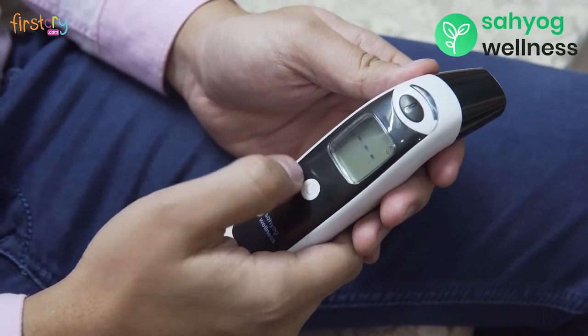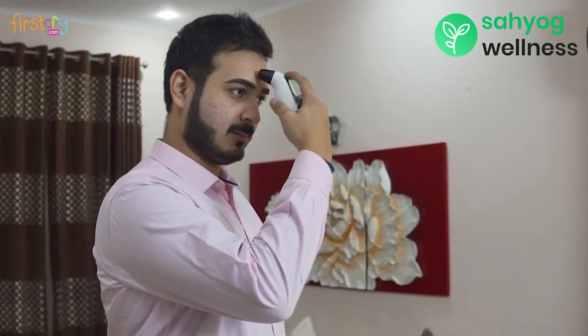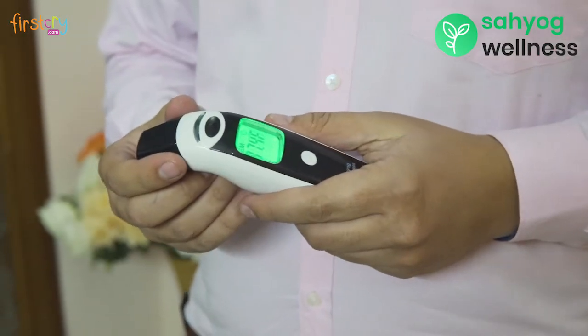To use in forehead mode, place it 1 to 3 cm away from any surface of your body and press the black button. The temperature will be displayed on the screen immediately.